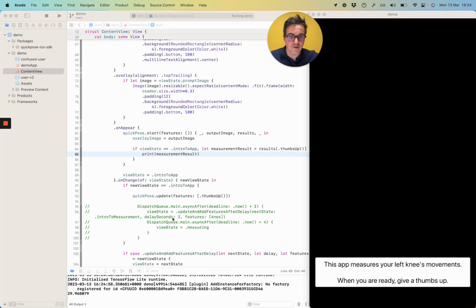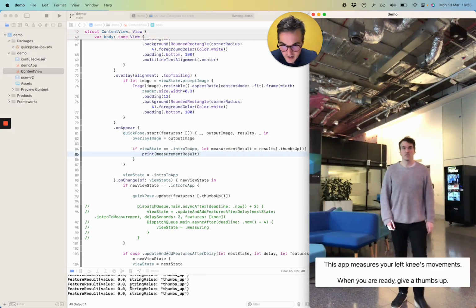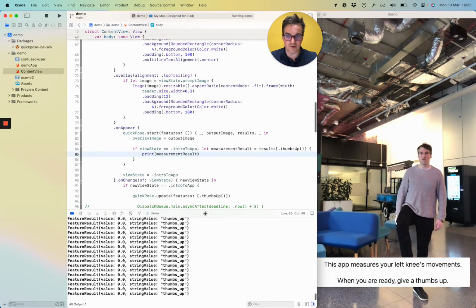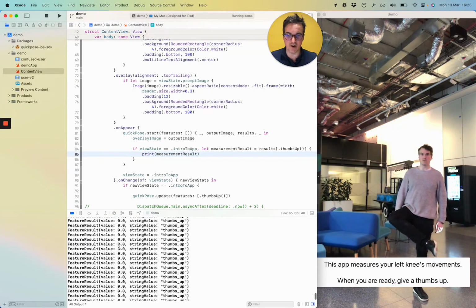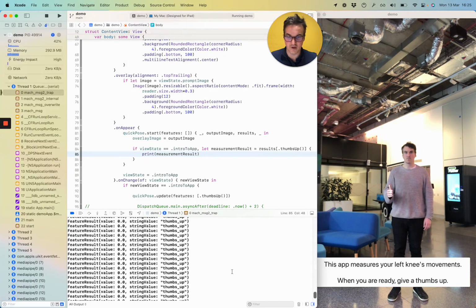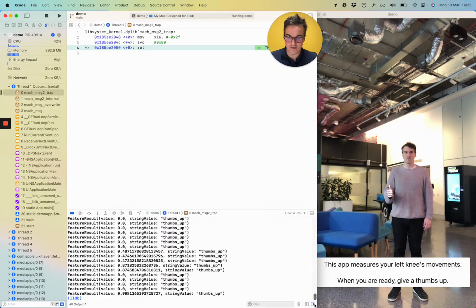So this is our thumbs up function, and it gives you a probability of the state. So you saw little flashes there. At the moment it's 0, but when there is a thumbs up, you would have seen it flash up to, oh, perfect. It will flash up to a higher value. So we've got some really high probabilities here, 0.8, 0.9. You'll note there that it's a bit jittery for now. We're kind of working on that, but we have some values here which we can work off.